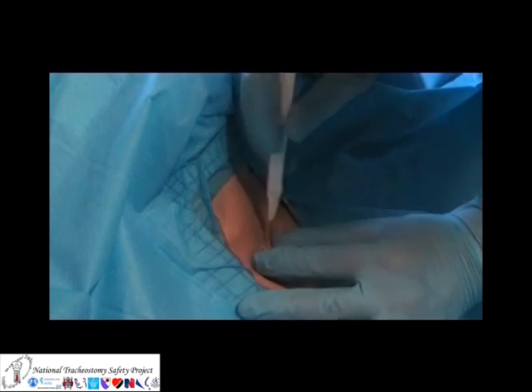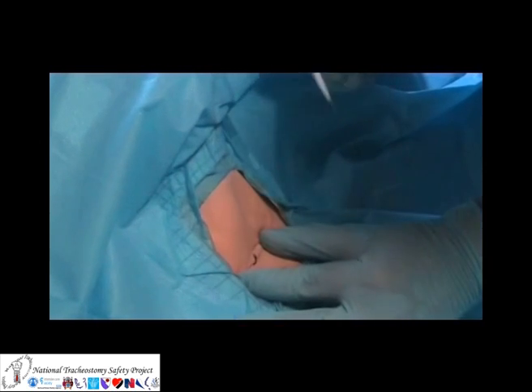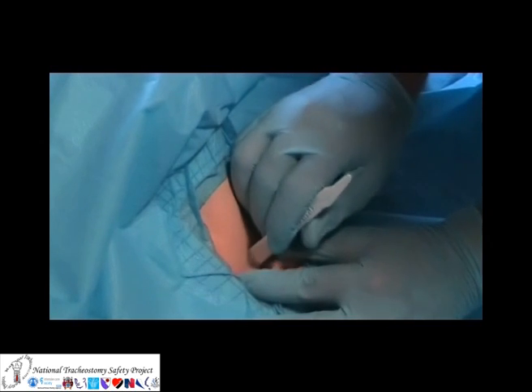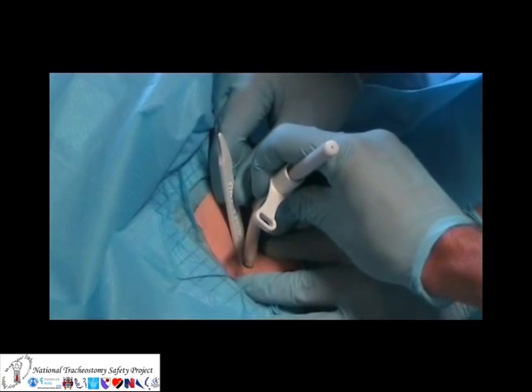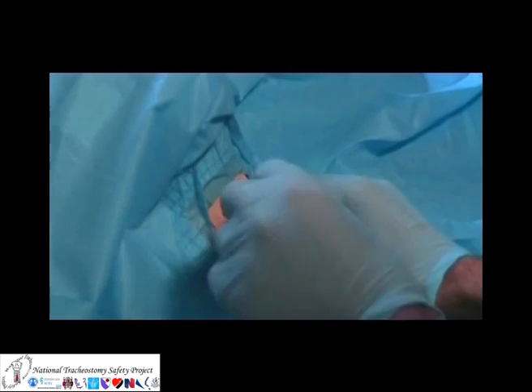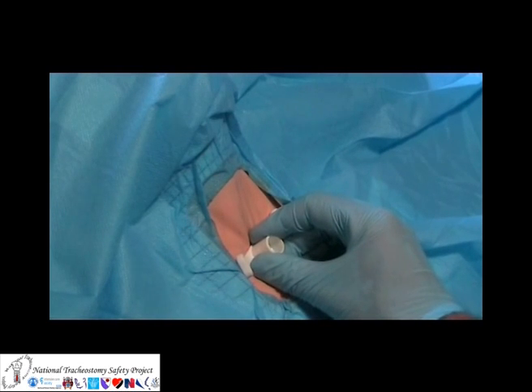Make a small vertical incision as shown here, followed by a stab through the cricothyroid membrane. The simple surgical technique then involves inserting the scalpel handle as shown here and rotating to open the cricothyroid membrane. A suitable cricothyroidotomy tube can then be inserted as shown. This should be held securely in place, where it can be connected to oxygen and ideally capnography.